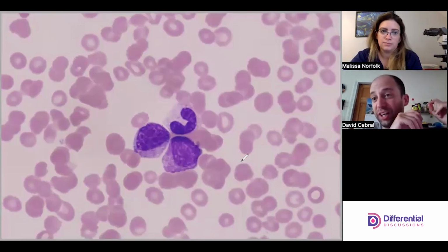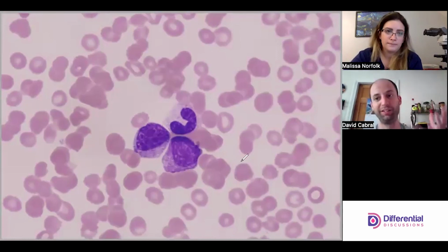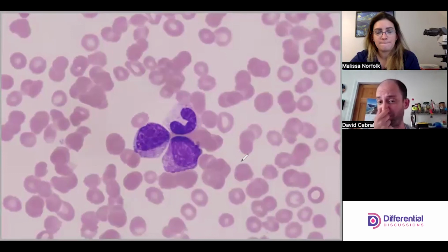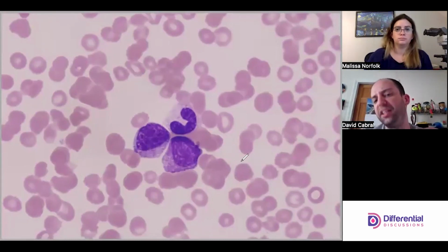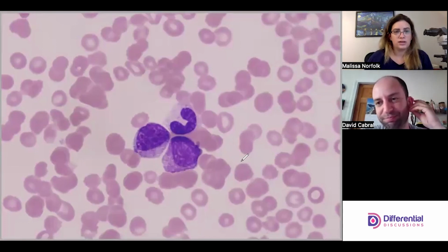And this is tricky, right? Under normal circumstances, you'll get much more consistency between the cytoplasm and the nucleus. But when we talk about putting these things in categories, myelo encompasses a period of time, right? So there's a bit of wiggle room in presentation. Yes. But usually they're not this different nuclear wise, right? But this is a malignancy. Right, and I think that's the thing.